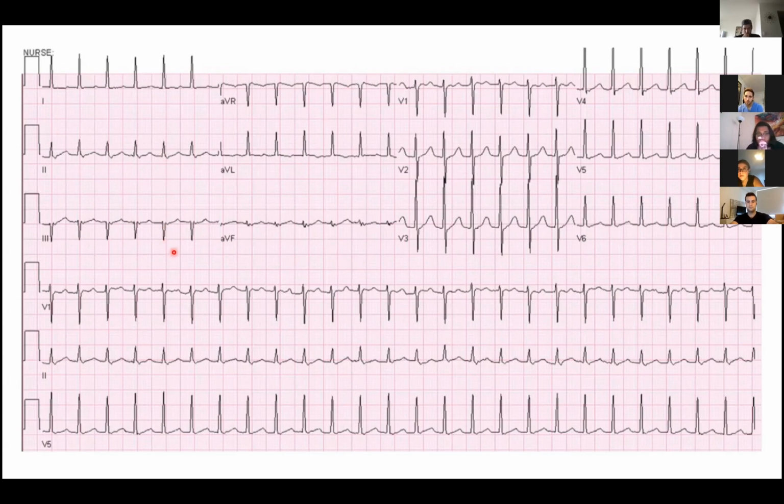If someone has a wide QRS, then you can see all sorts of notching. But this is a narrow QRS, pretty narrow. So you should not have these weird notchings that extend more than 40 milliseconds later. And then if you go to aVF now, knowing that you have suspicious, repetitive deflections here that look like retrograde P waves, it just confirms that there are retrograde P waves in inferior leads.